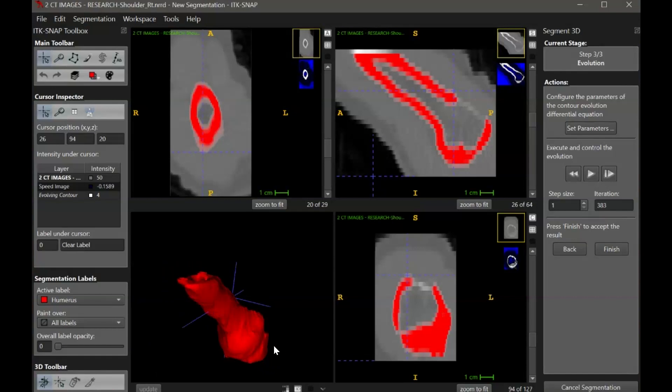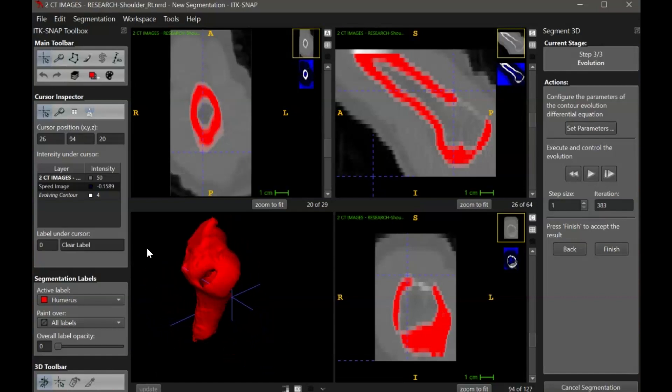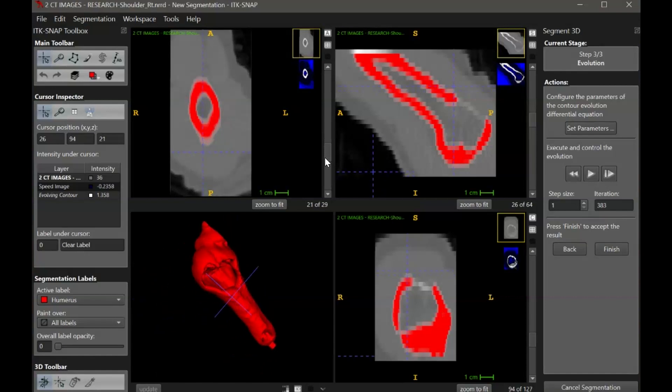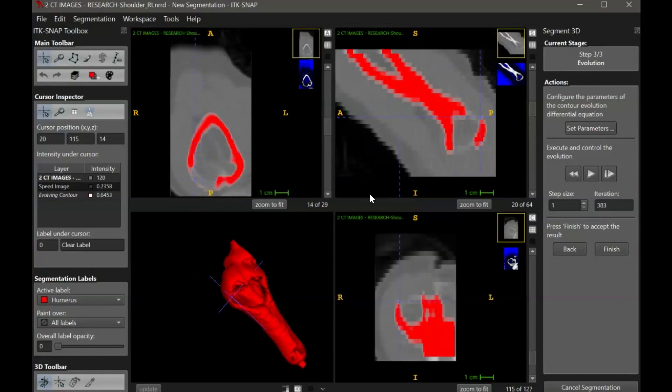If you see any gaps in the segmentation, you can go back and add bubbles, or you can reactivate the contour evolution to let it go for several more iterations.